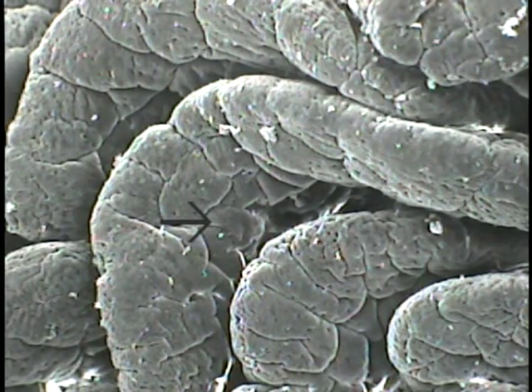A scanning electron micrograph showing the surface features of villi taken from the proximal duodenum of a human individual. So these are large spatulate type of villi, that is the apical surface of the villi within the intestinal lumen. This was taken from a bypass patient with surgery due to obesity. This particular field illustrates the top of a villus at higher magnification. So we're looking at the point of the villus as it extends into the intestinal lumen.